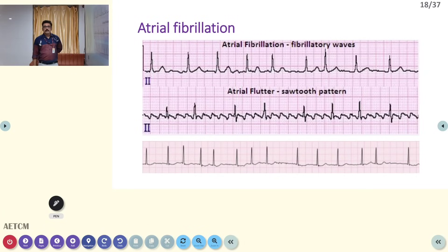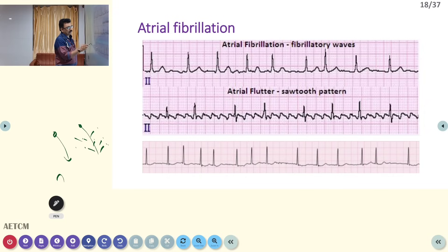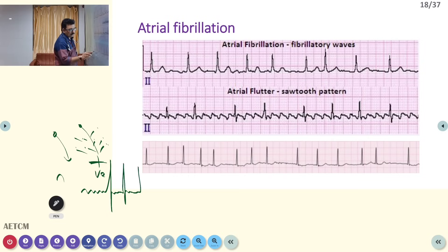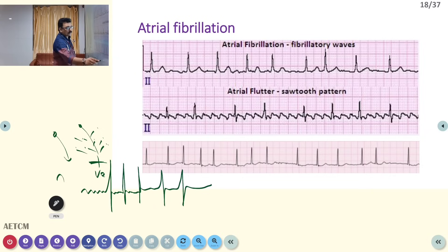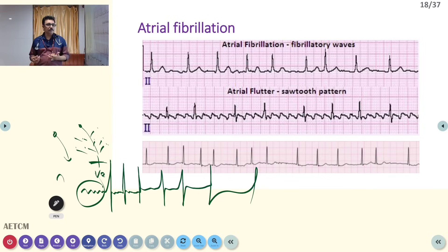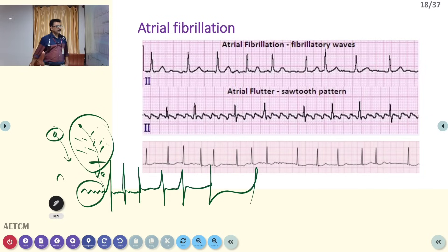In atrial fibrillation, proper P waves are not seen. Instead of a single current from the SA node, multiple areas produce current simultaneously — around 600 beats from the atria — creating a wavy baseline. Some current is transmitted to the ventricle in a random manner, producing a wavy baseline with an irregularly irregular RR interval. This is the hallmark of atrial fibrillation.